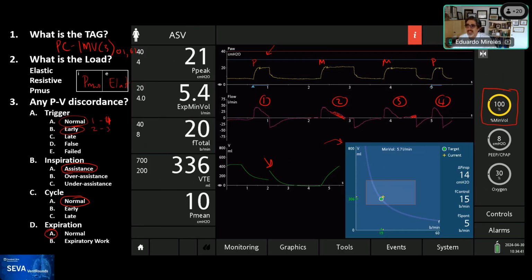And if you are receiving medications that will take out some of the drive, that may be even more evident. So decreasing your minute ventilation to a level in which the medulla starts driving, so that your CO2 starts increasing, may help avoid that over assistance. So great point. In that sense, I guess you're all right. I mean, this patient was over assisted. So I'll take that.